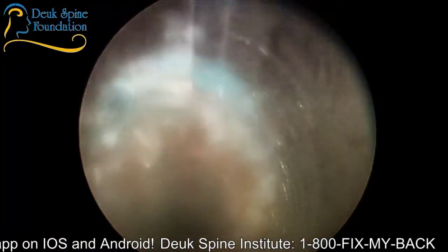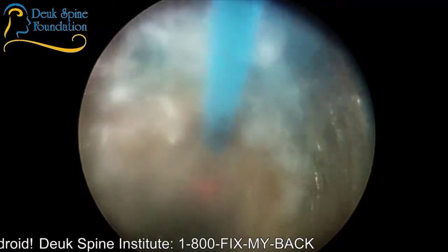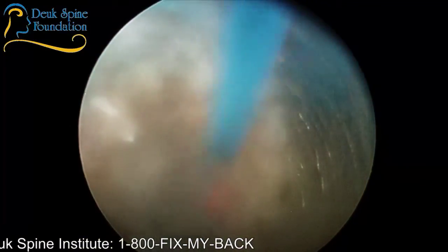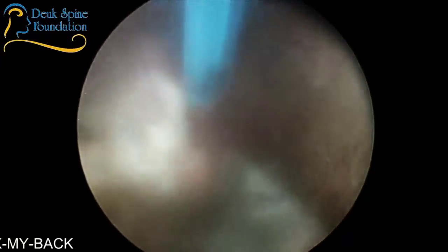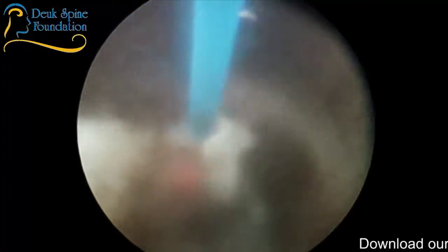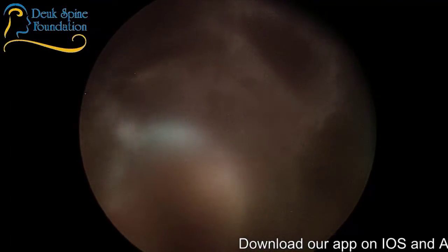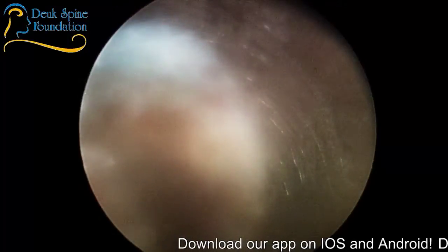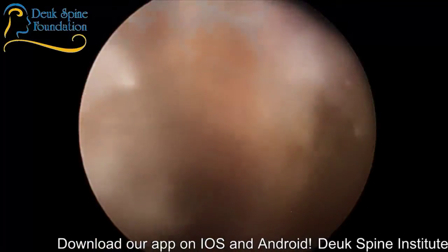So that's what the Deuk laser disc repair really is. It's a debridement of the disc herniation, and it's not done in any other surgery. And that's why Deuk laser disc repair has the highest success rate for curing back and neck pain, 95% average, because we're addressing the source of the pain. It's pretty remarkable as I reflect back on the history of this surgery. These patients don't end up getting fusions because I fix their problem endoscopically.